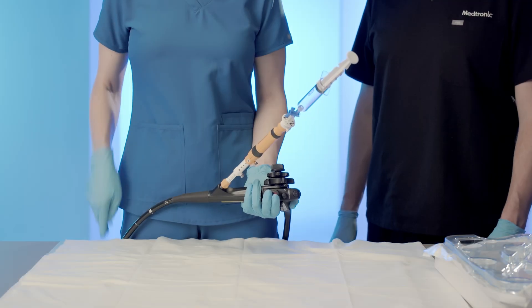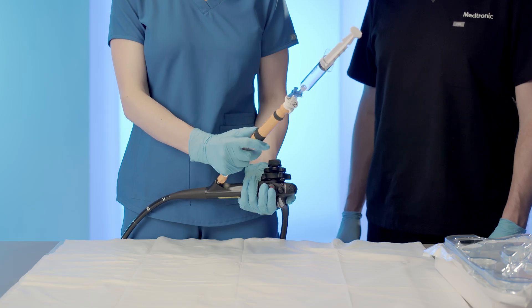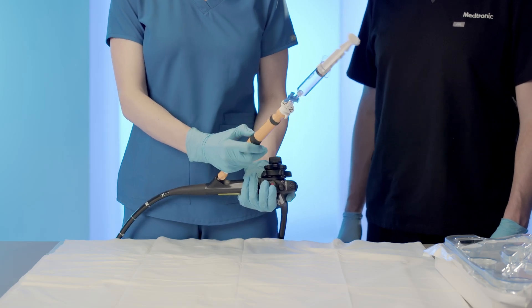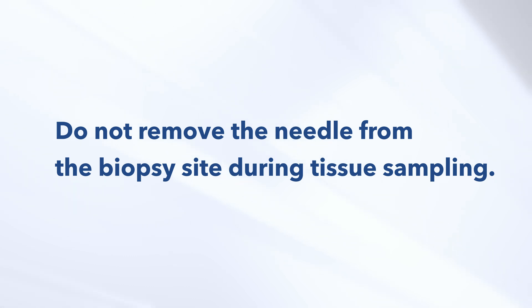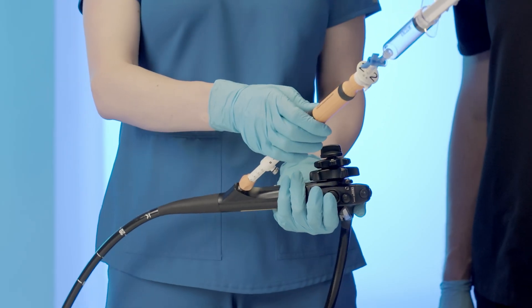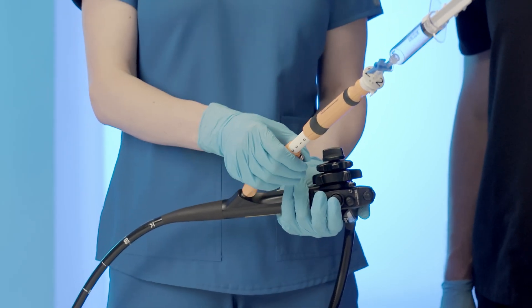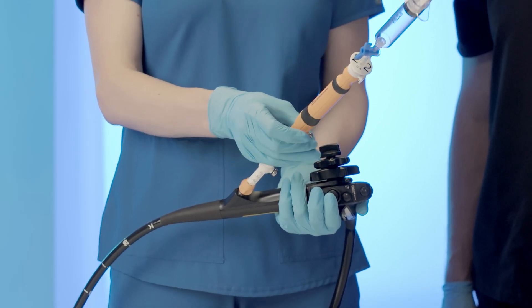Sample collection. Gently advance and retract the handle in small increments to advance and retract the needle within the biopsy site. Do not remove the needle from the biopsy site during tissue sampling. Upon completion of tissue biopsy, retract the needle into the sheath by pulling back on the handle of the device. Lock the thumb screw on the safety ring at the zero centimeter mark.